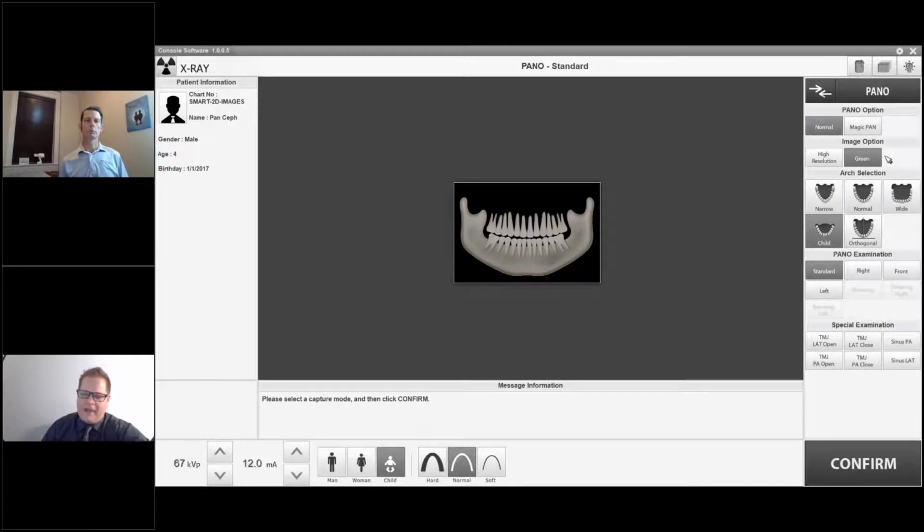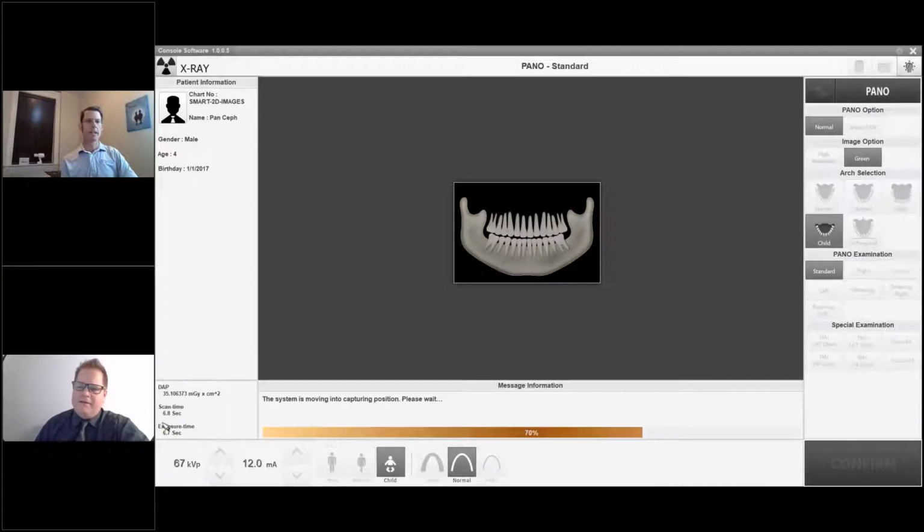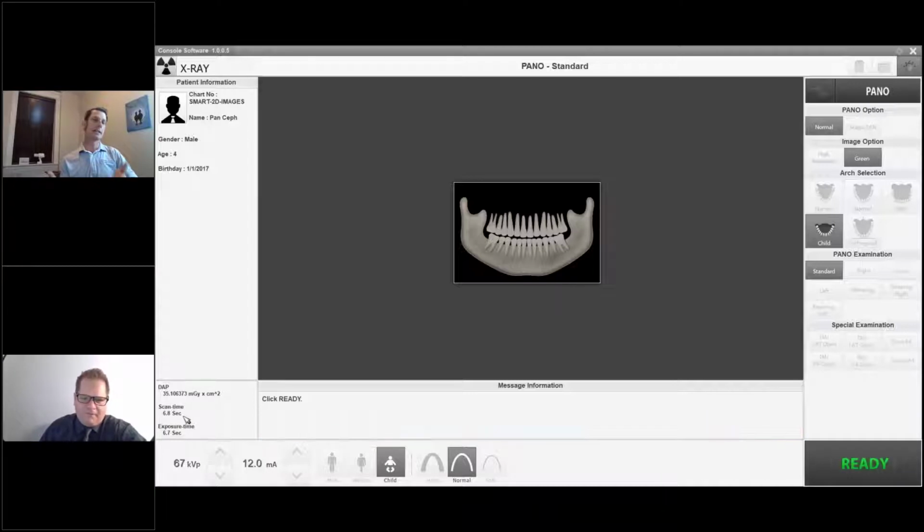So the regular pan is about 13 seconds, and the green setting is about, I think, Jim, is like 7 point something in there. Yeah, it takes it down to really less than 6.8 seconds scan time, which is the rotation on there. Right. And you're still going to get a high quality image. It's just going to get the patient in and out with those patients that do have issues or radiation concerns, really, on there for that. So that's definitely one of the things there.